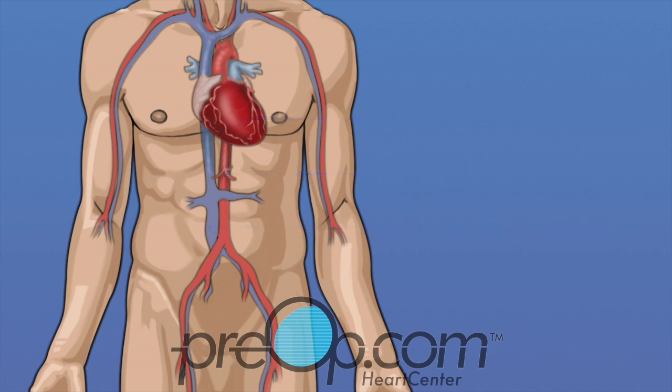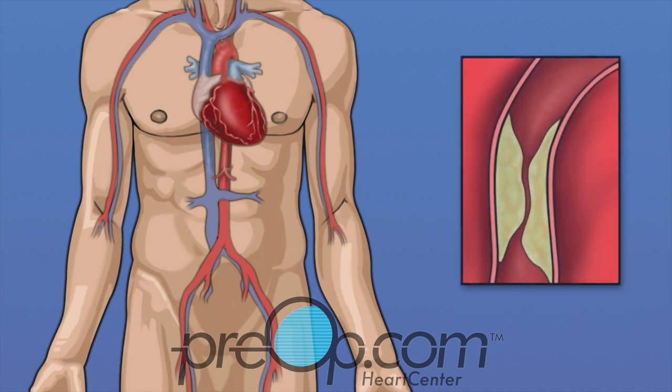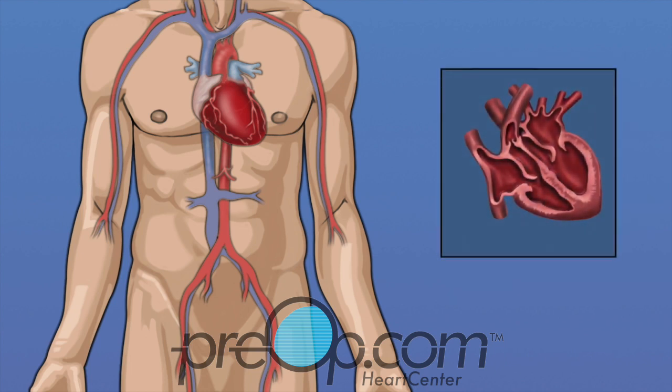During a cardiac cath, your cardiologist will test how well your heart muscle is working. The arteries that carry oxygen to the heart are examined, and blocked arteries can be identified. The inside of the heart, the walls and important flaps called valves, are checked for problems.